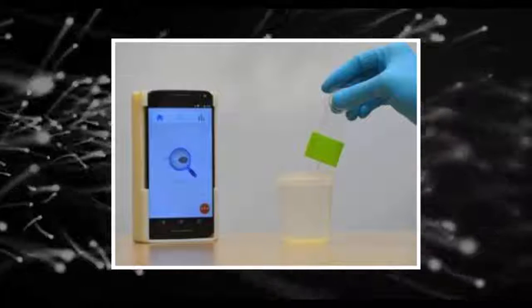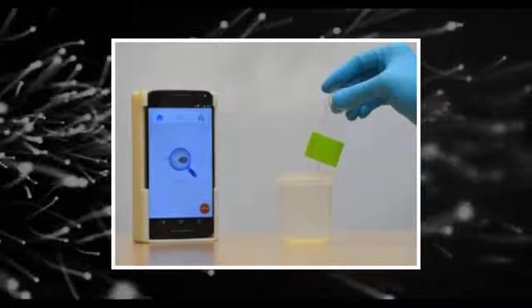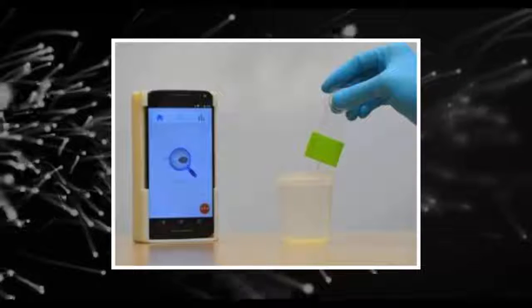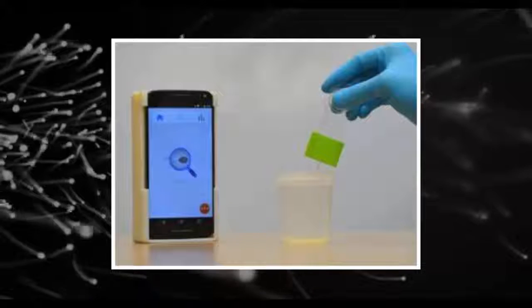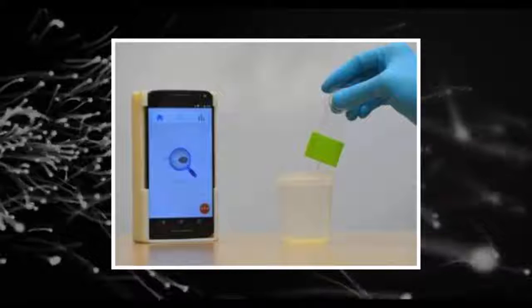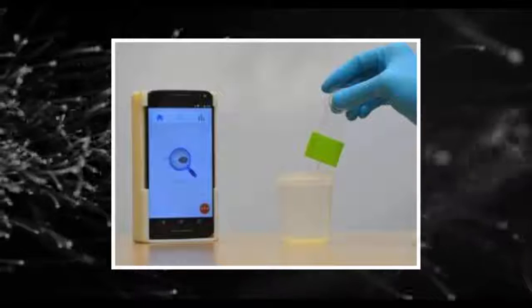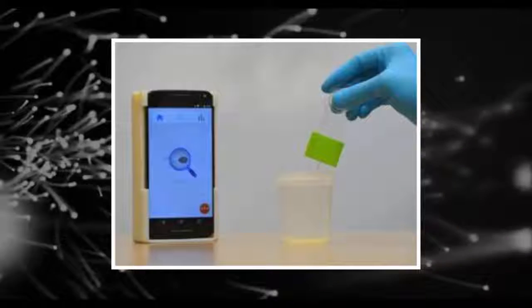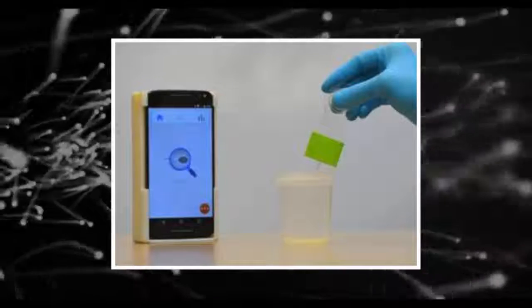Such devices can also help men monitor their sperm quality even if they're not trying to conceive. Getting a vasectomy, for example, requires sperm testing weeks afterward to ensure the procedure worked. And men hoping to improve their sperm quality by making diet, exercise and lifestyle changes could use home-based testing to monitor before and after differences.